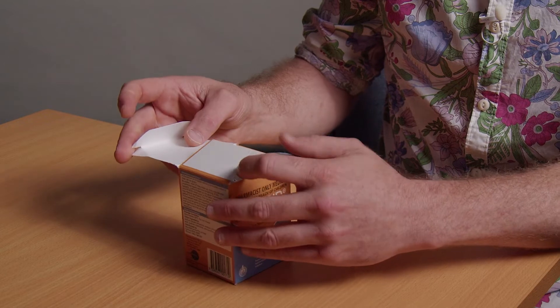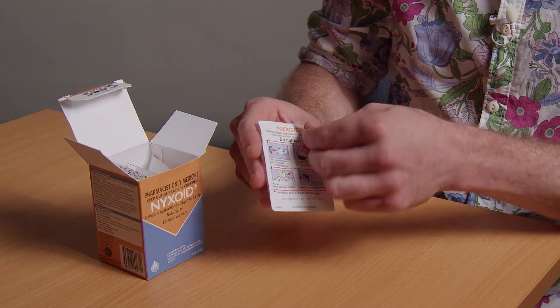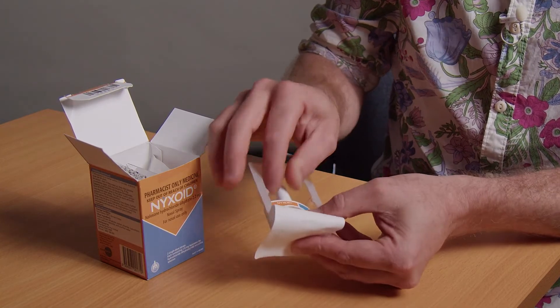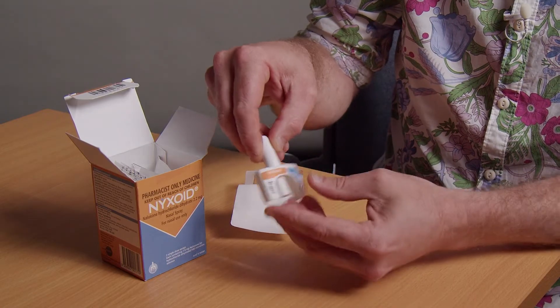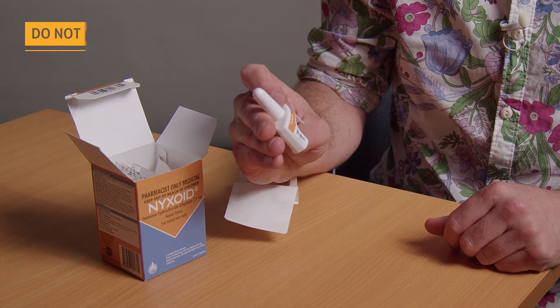Open the box and take out one of the two packets it contains. Peel back the package and remove the nasal spray. You'll also find instructions on the packaging. Please note the spray contains one dose only, so don't try a test dose — you'll waste the product and it'll no longer work.